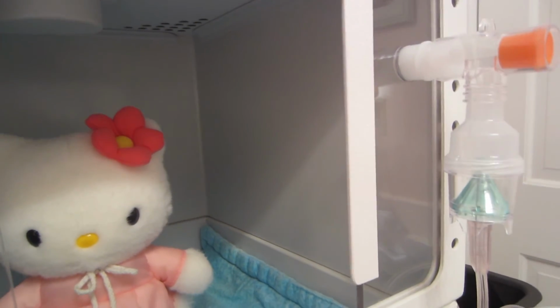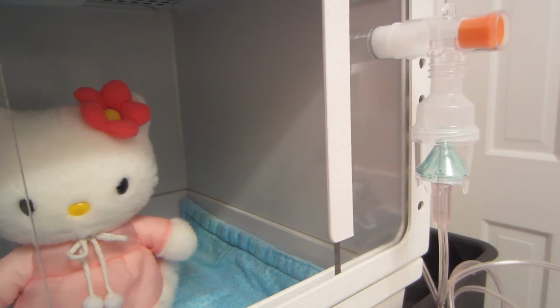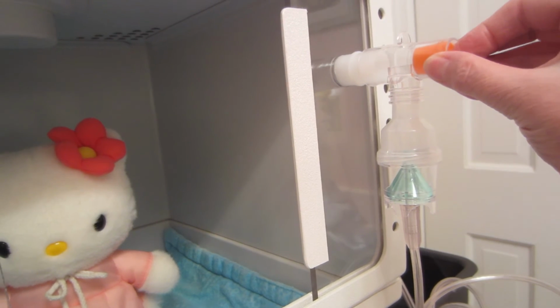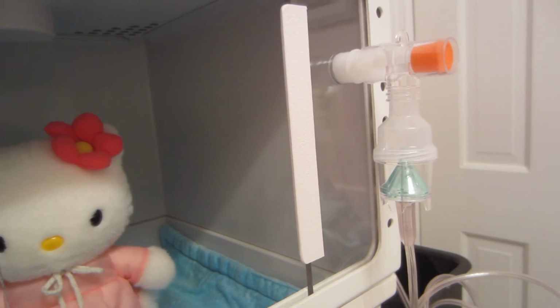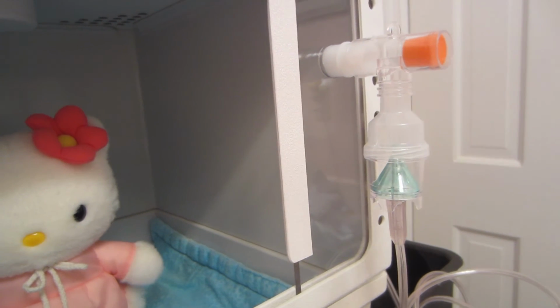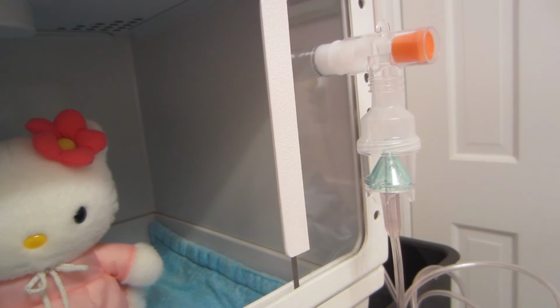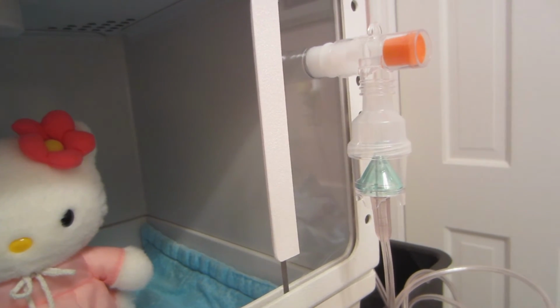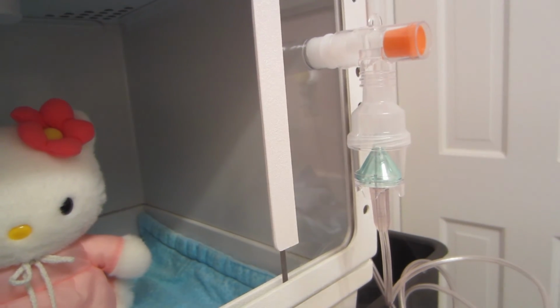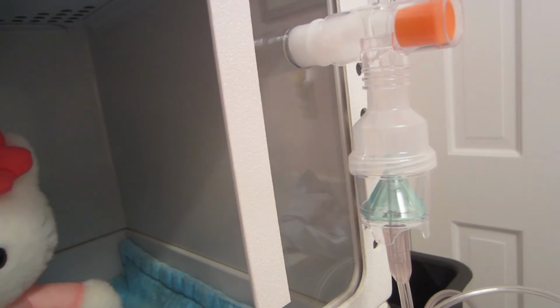And generally you would do this twice a day for a really sick kitty. You can put more medication if you need to, more than 250 milligrams, but they say that 250 is generally all that's necessary. And it's the same dosage for kittens or for adults. Weight and age don't matter. They all get the same amount because they're actually breathing it in, and the size of the lungs does dictate how much medication they're actually taking into their system.